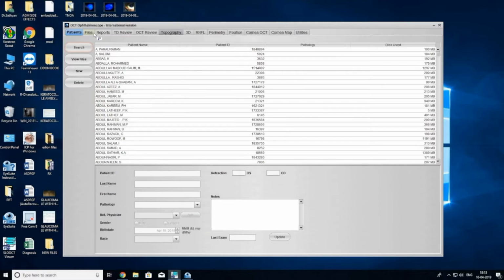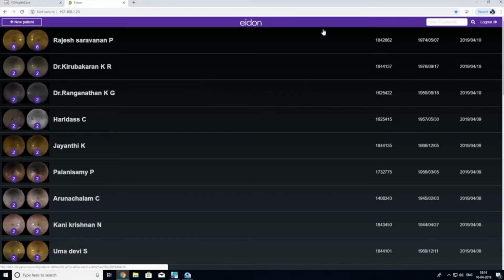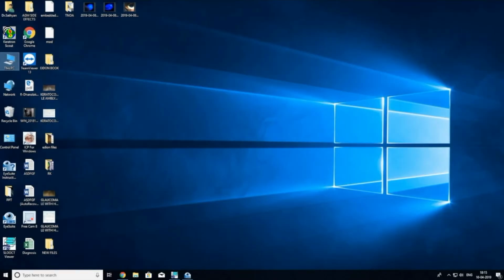Then the fundus photography icon is clicked and its data set display confirms its priming. Lastly, the corneal topography is wielded, initiation of which is quite similar to the previous applications.